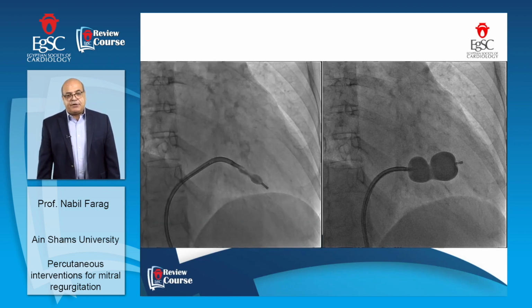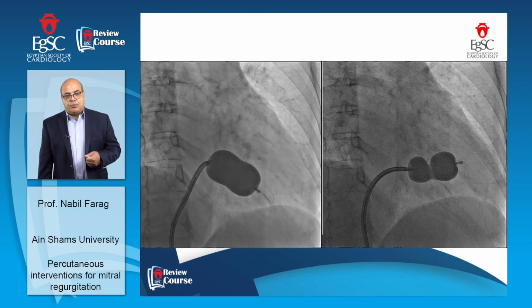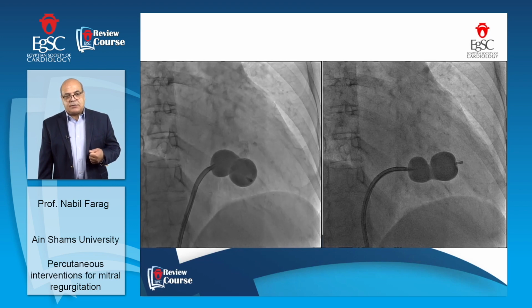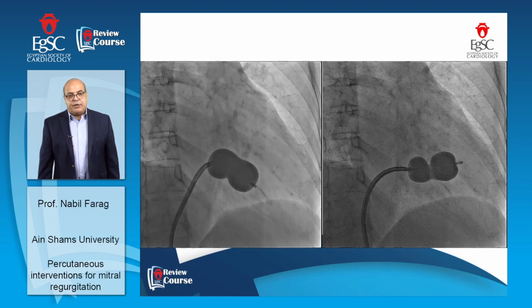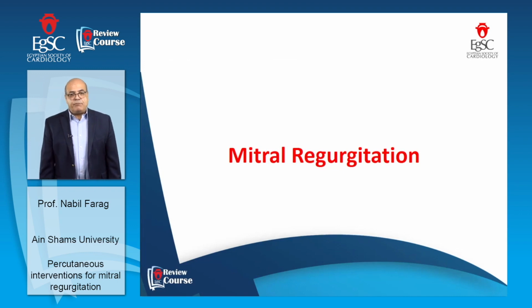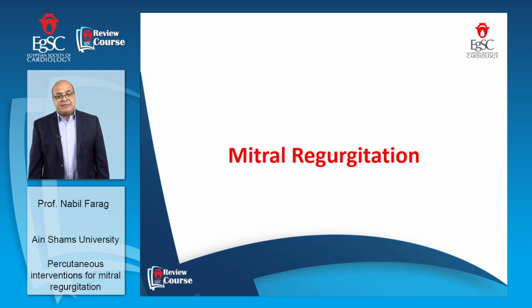And it's very clear here that you inflate first the distal part, you pull it back till you feel some resistance, that's you are across the mitral valve, then you inflate the proximal part, and lastly the mid part that splits the commissures of the mitral valve. The most important part of my presentation today is the mitral regurgitation. Mitral regurgitation is new for us, and we have new techniques.